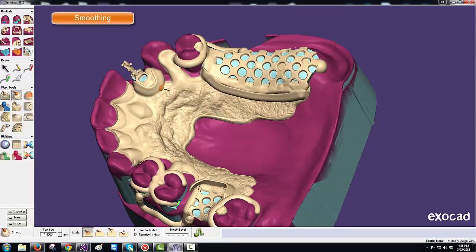Okay. Now with this tug tool, it's very convenient to adjust the top of a finish line, or if you wanted to relocate the post or pull up some wax and make it a little thicker. It's a great tool, and increase the size of it with plus and minus key, or control holding down with the scroll wheel on the mouse.